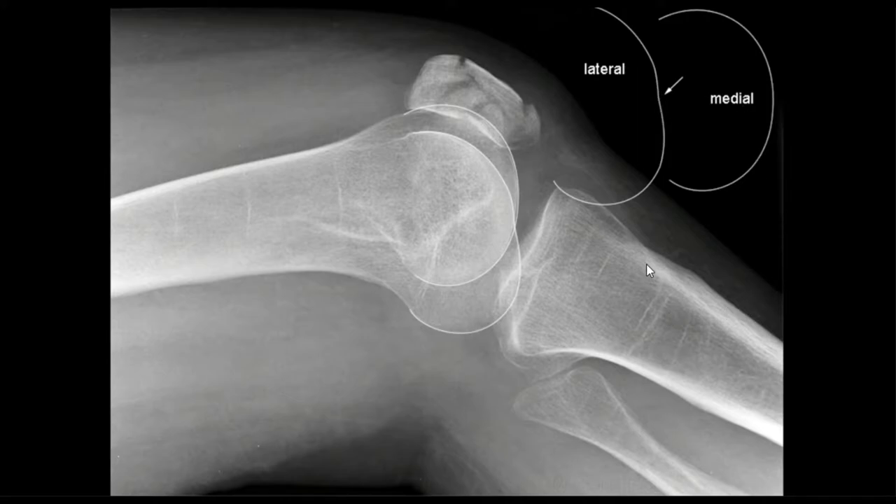This example is clearly laterally rotated because we can also see the fibula is completely free of superimposition from the tibia. Using the fibula is a great way to tell rotation, especially when it's exaggerated like this one, but it's not always a clear indicator as we'll see later in the video.